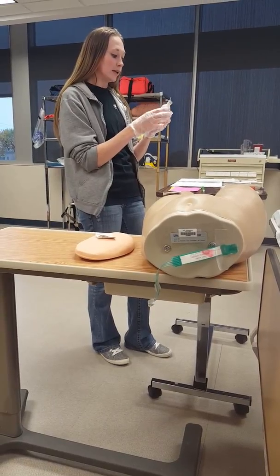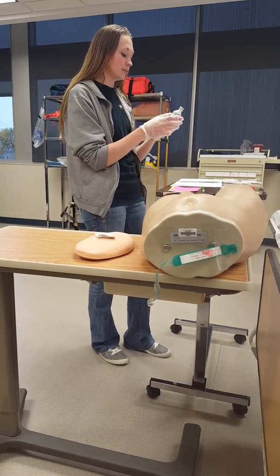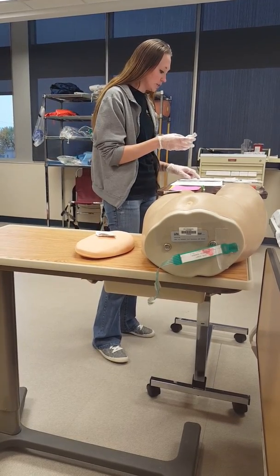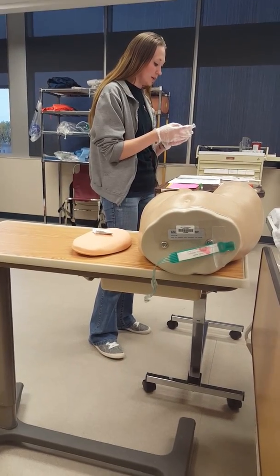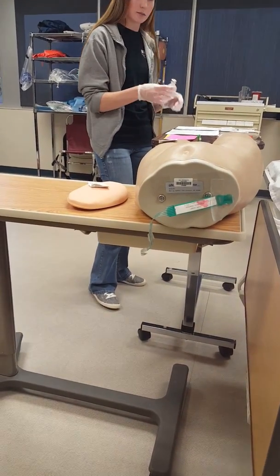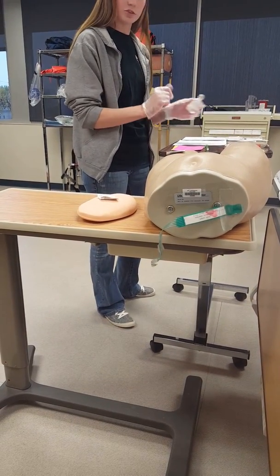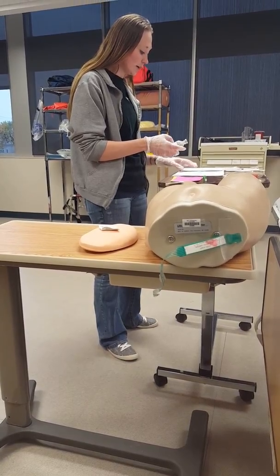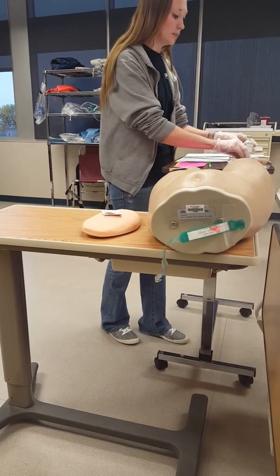It's not out of date, and it says Novolog, and I will be giving you 10 units, and I'm going to check it with my doctor's orders, and it's Novolog, and I'm giving you 10 units. And checking my MAR as well. So that says I'm going to be giving you Novolog. I'm going to be giving you 10 units because you were at 318.